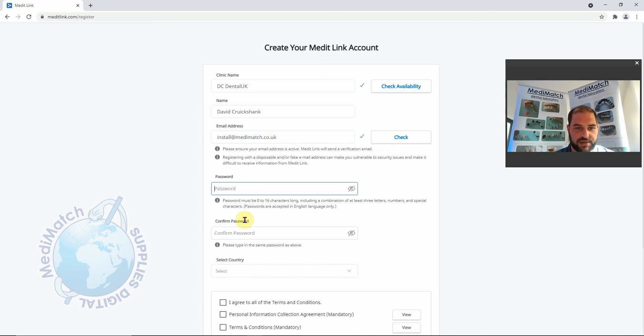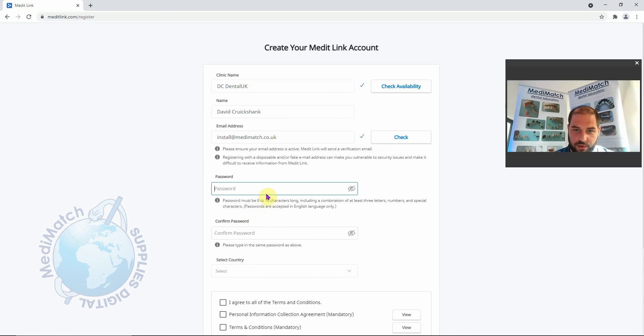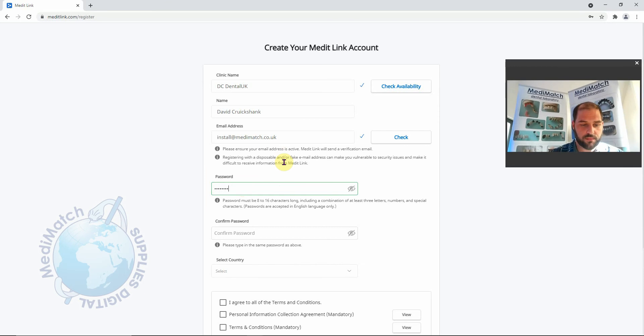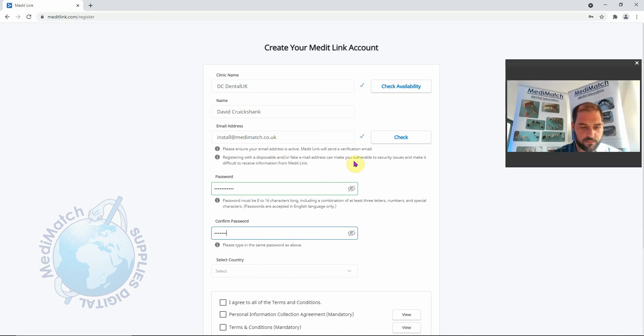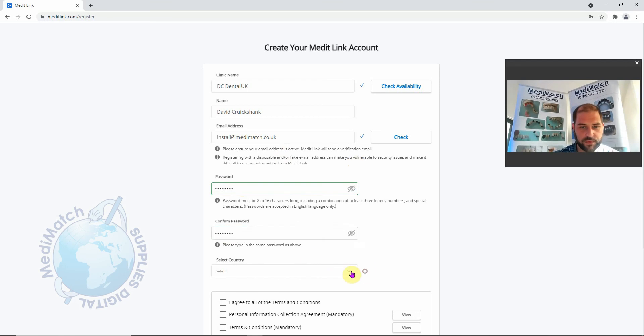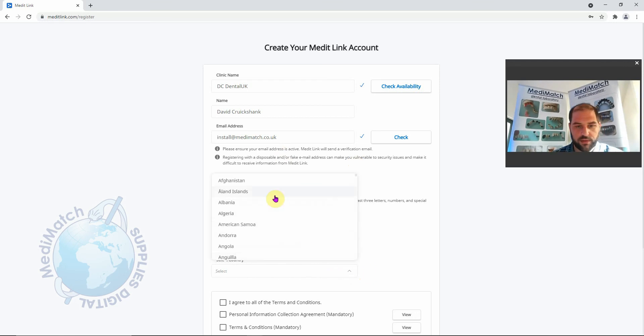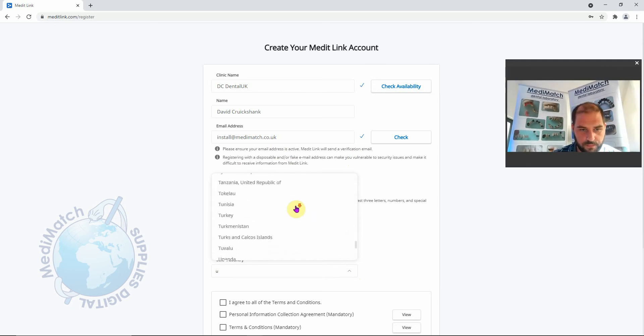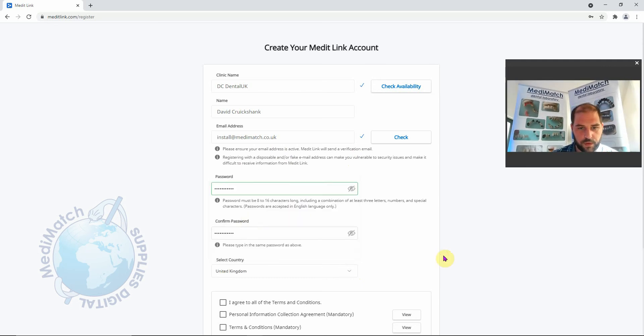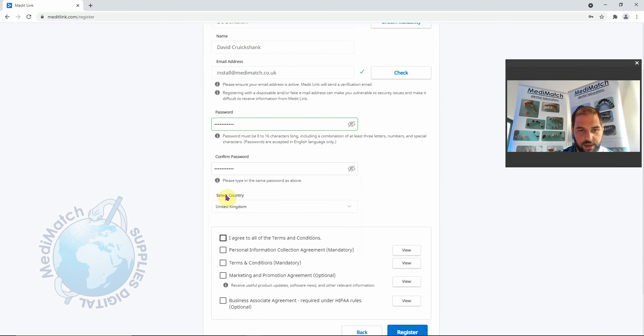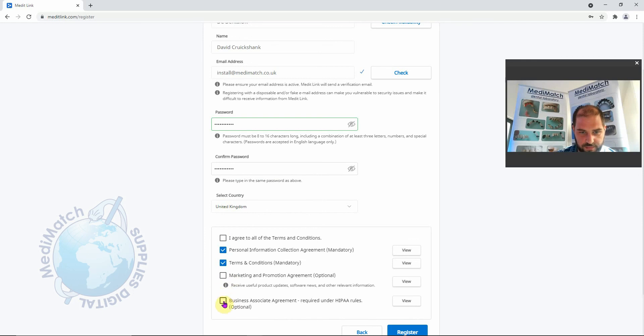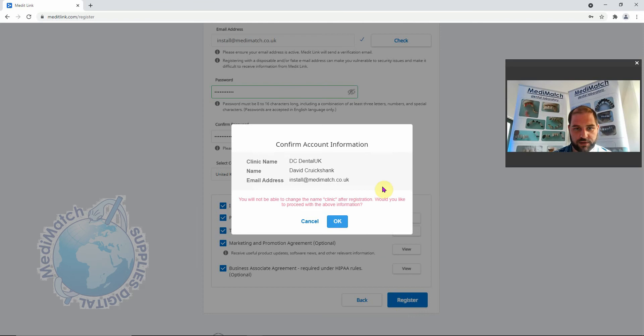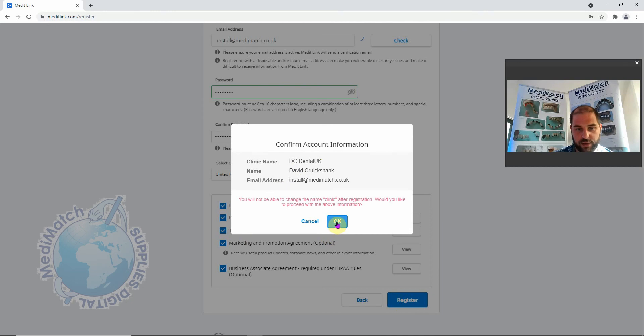The next thing is to create a new password. It must be between 8 and 16 characters long, a combination of at least three letters, numbers, and a special character. Go ahead and do that, and confirm it. Select country. Agree to the terms and conditions as you see fit. This one's mandatory, this one's for marketing. So I just tick agree to them all and click register. So it's going to be setting up as DC Dental UK with my name and this email address. We're going to click okay.